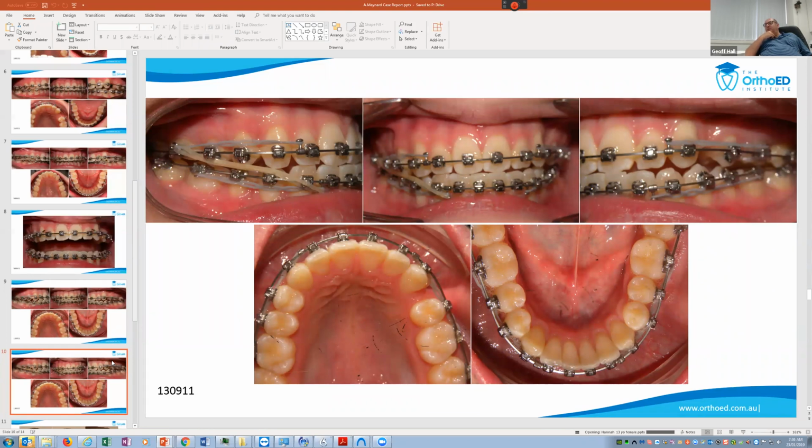I was thinking of trying to compensate for the fact that their muscles are fairly relaxed at night and their jaw may end up swinging to the side that you're trying to get the correction on and losing the stretch. Look, I honestly can't answer that question, because I do elastics at night on one side, but that's more if I just want to maintain that side. Yeah, that's what I'm asking.